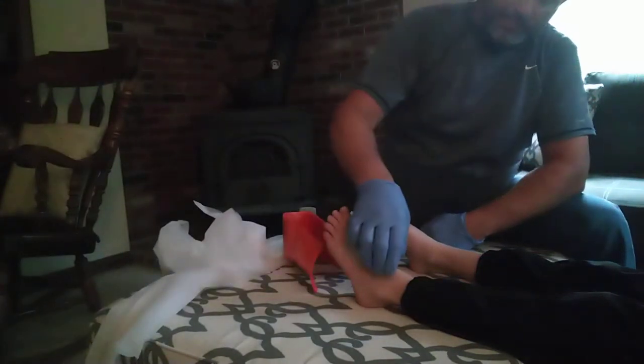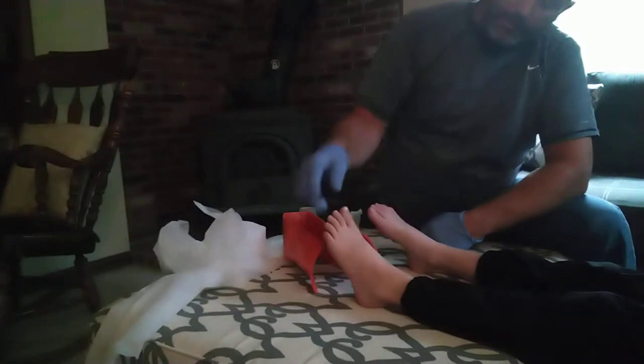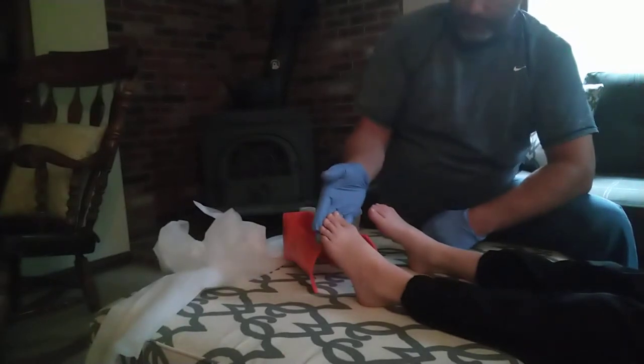So I'm going to check CSMs real quick. Check for a pulse — I got one. Can you feel me touching? Can you wiggle your toes? Perfect. Push down on my hand. Perfect.